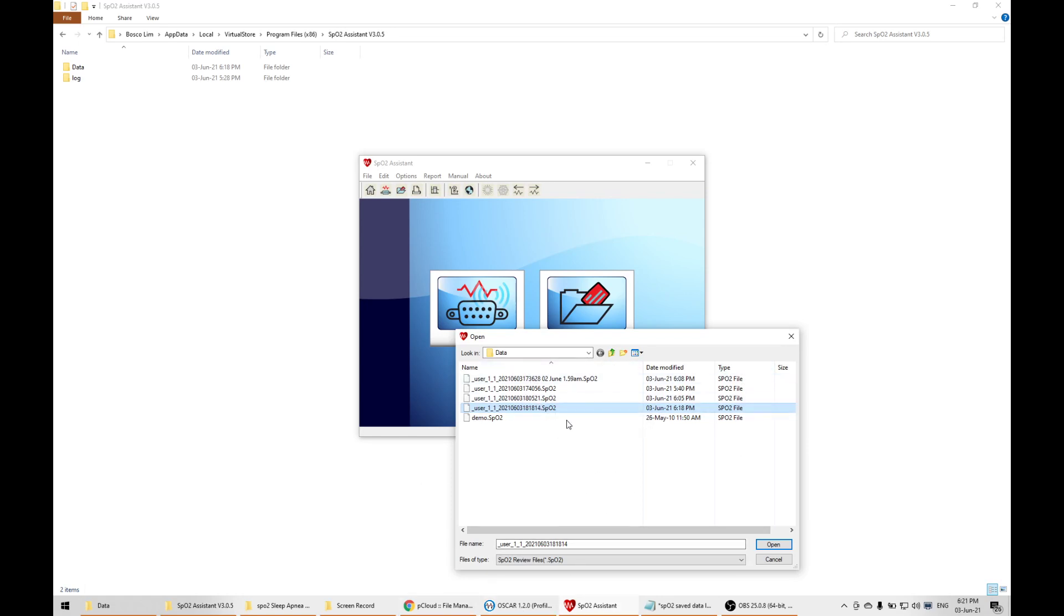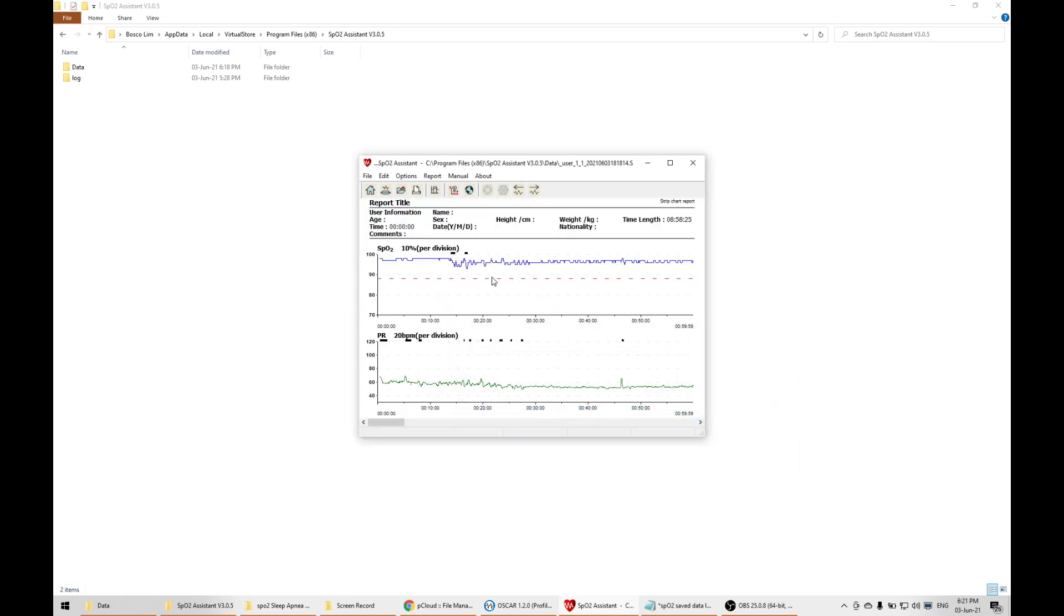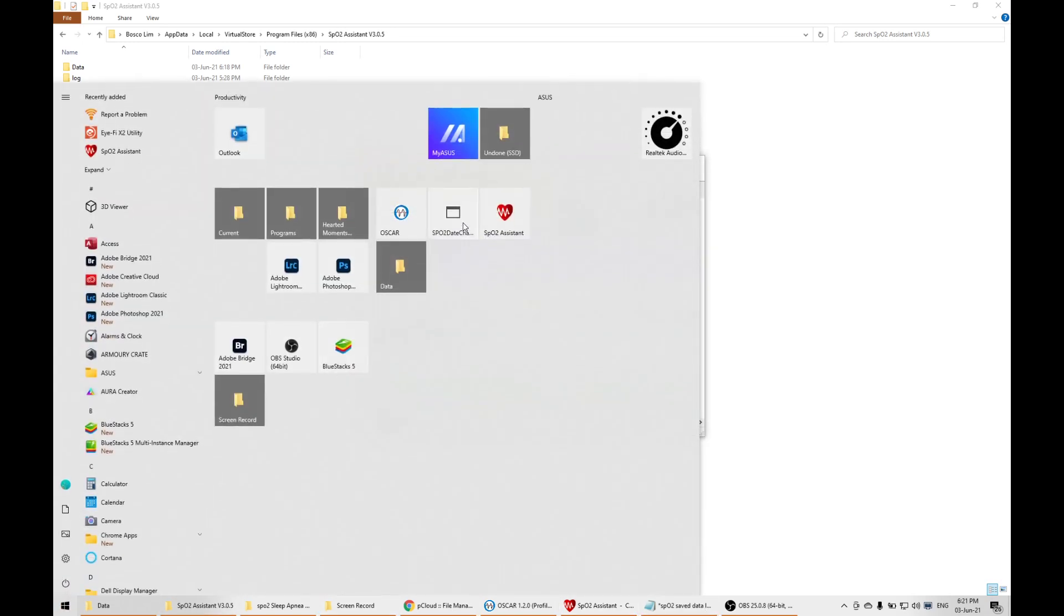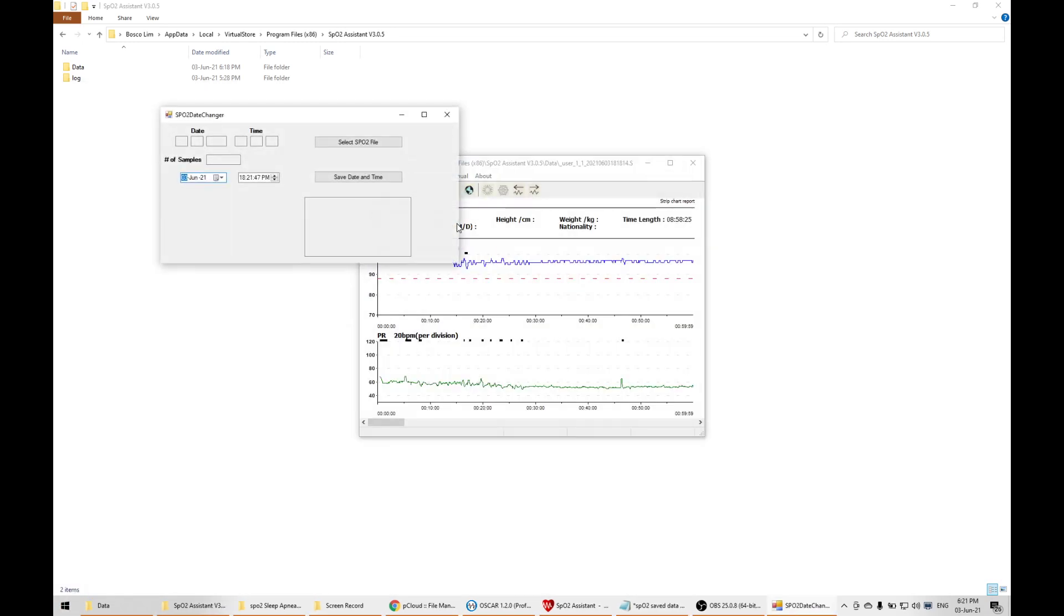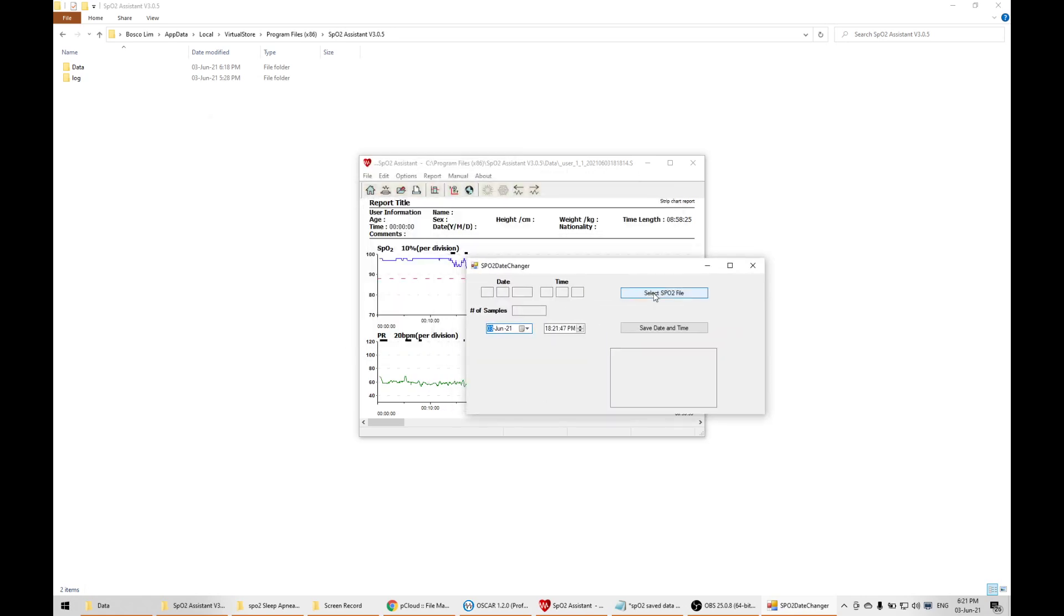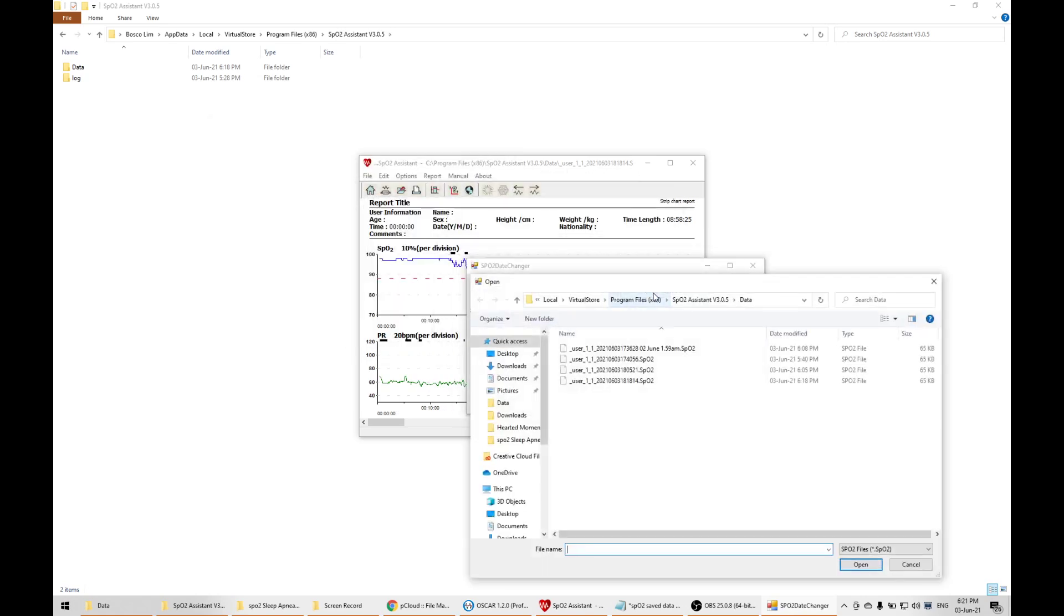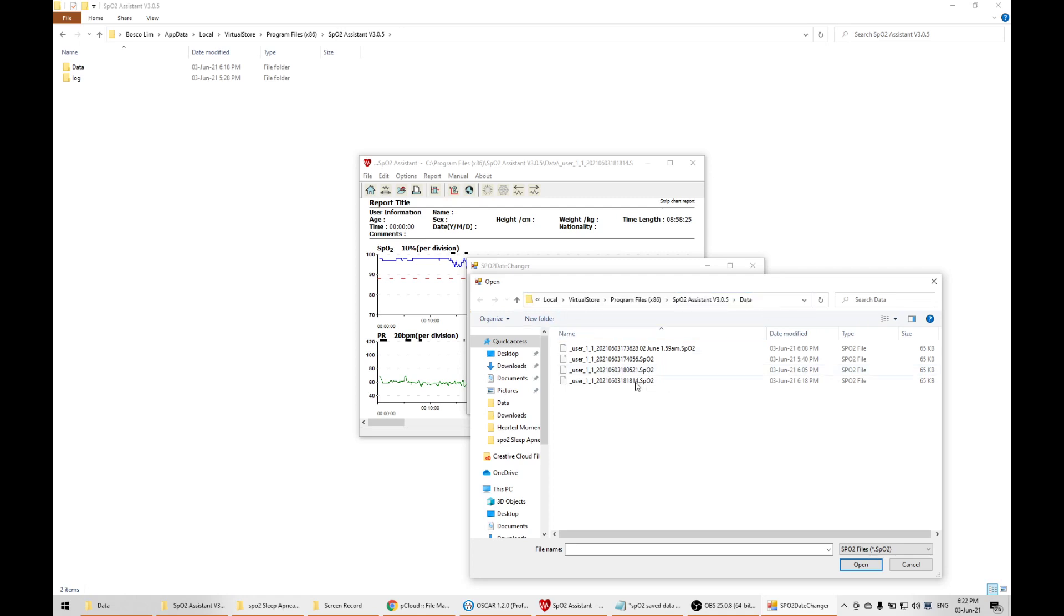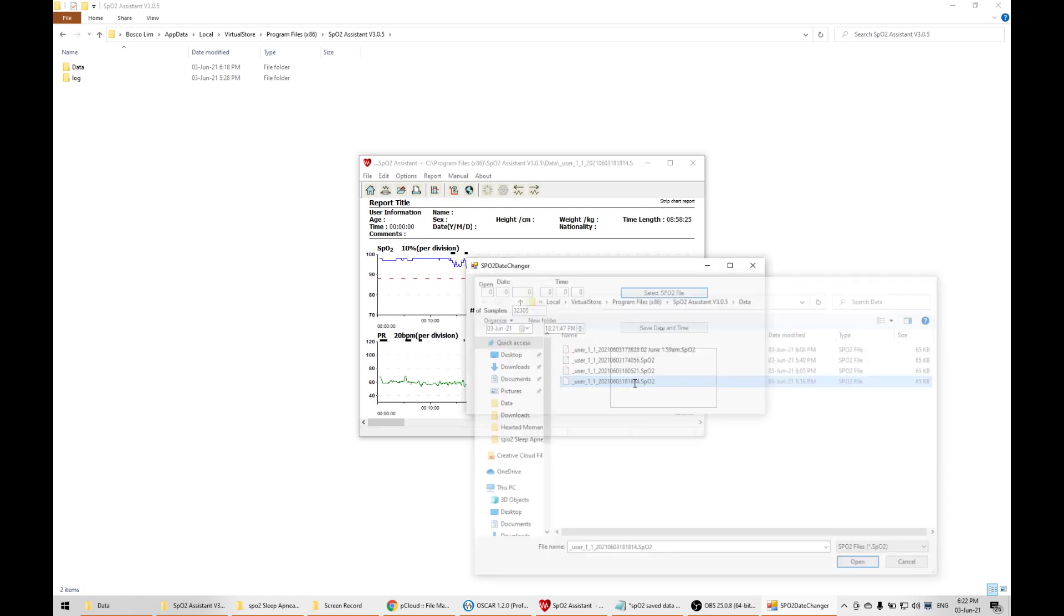Once this is done, I'll click in and see it's there. The next step is how do I change the time. I'm going to go to this SPO2 date changer and select the file. Now I can find the file in this link, but not in the link given from the SPO2 assistant. Once I find this link, I'll proceed to the latest file, 6/18 PM, which I just extracted.